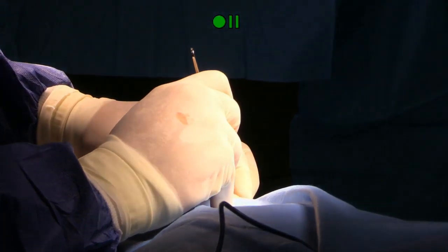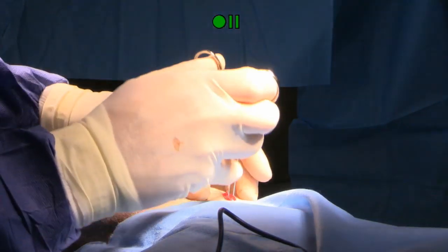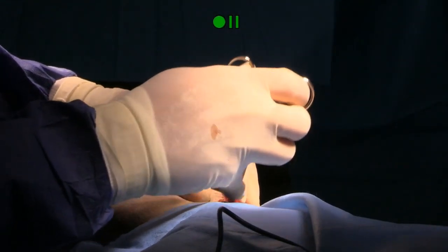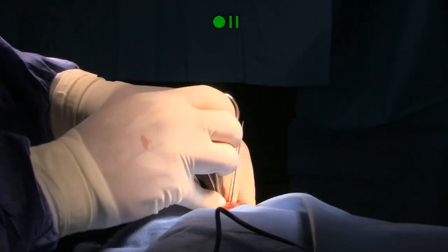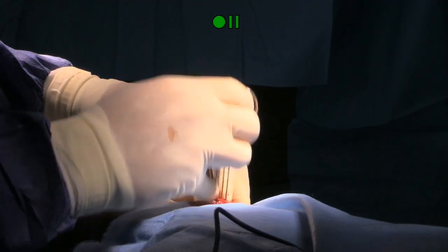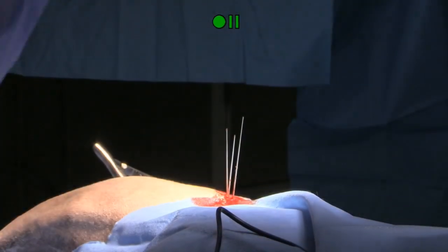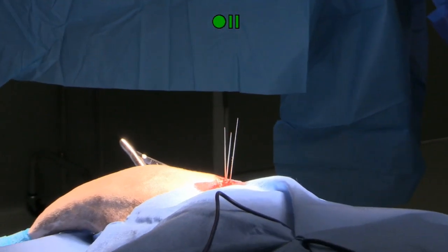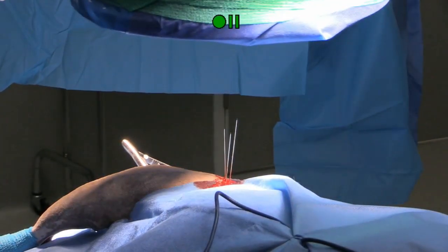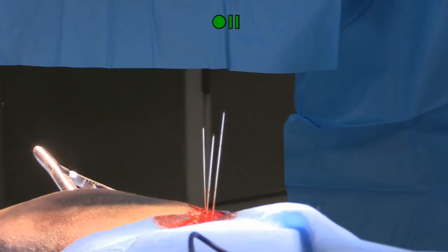So next thing we're going to do is just open up a space here for our drill bit. I know where that pin's going, so I'm just stabbing essentially blindly down onto the iliac wing there. So again, if you didn't catch that, James is using a scalpel blade to cut down onto the pin all the way down to the bone so that the drill bit will slide over that pin easily without engaging too much soft tissue.